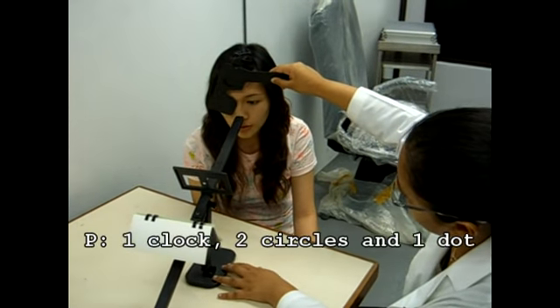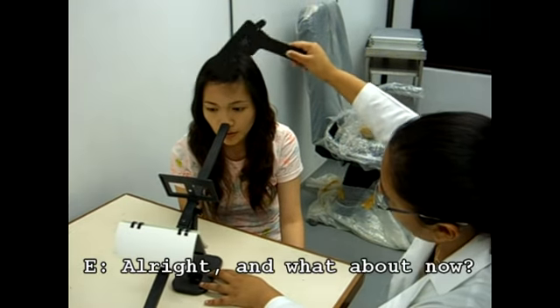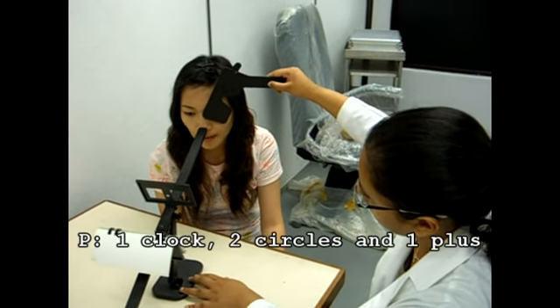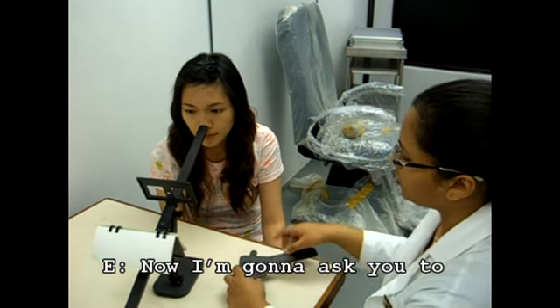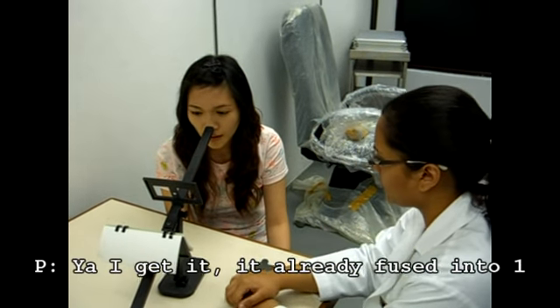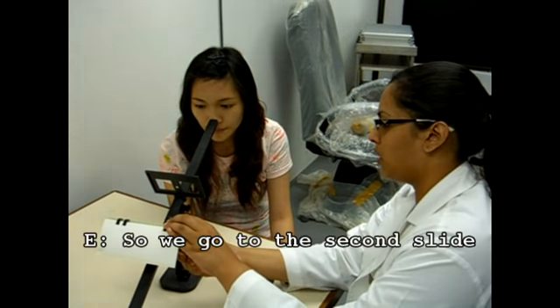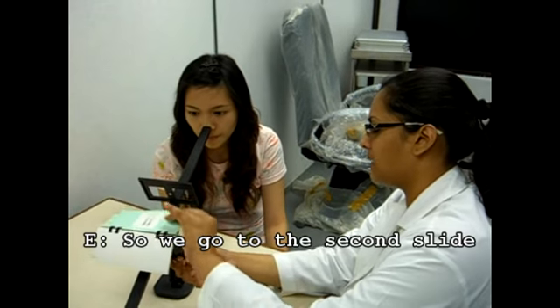1 clock, 2 circles, and 1 dot. Alright, and what about now? 1 clock, 2 circles, and 1 plus. Okay, now I'm going to ask you to try to make the 2 images into one. Yeah, I get it. It already fused into one. So we'll go to the second slide.